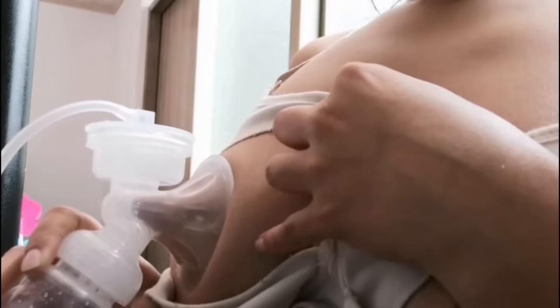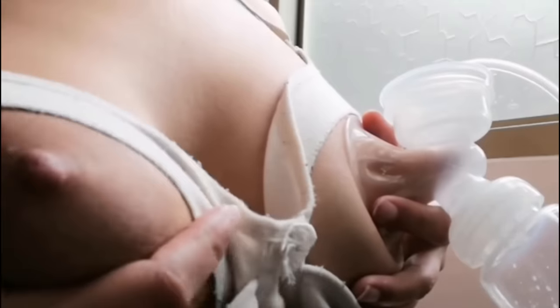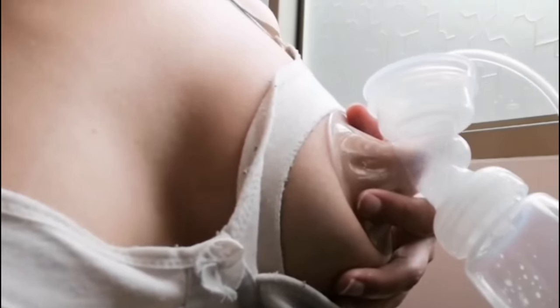First, make sure the equipment is clean and sterilized. Then, sit in a comfortable chair and relax. Place the breast shield over your breast and adjust the suction level to your comfort. Start with a low suction level and gradually increase it as needed.